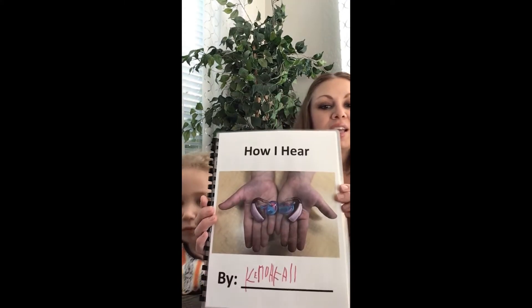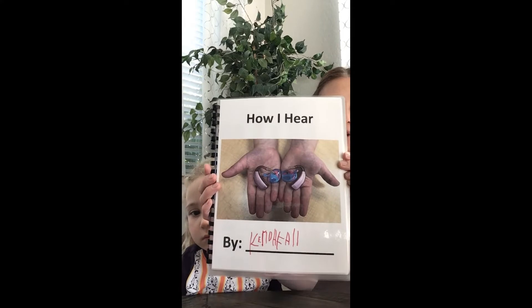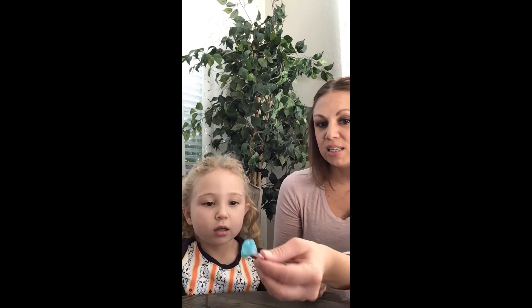She made this book in school called How I Hear, and these are the parts of her hearing aids. She's going to demonstrate what it looks like as she takes them out, and then we're going to go over the pieces and what those look like. Okay Kendall, do you want to take out one of your hearing aids? So we're going to show them what are the pieces.